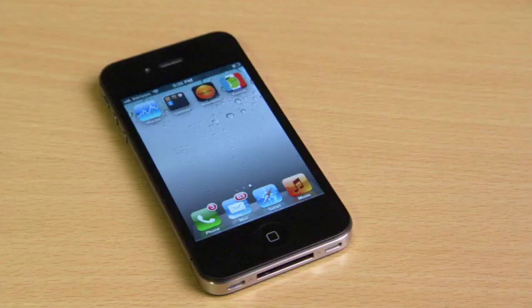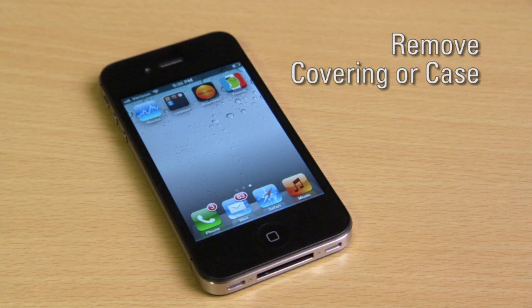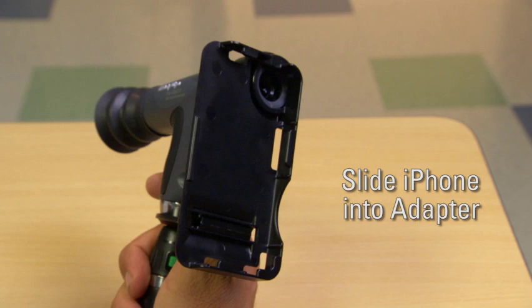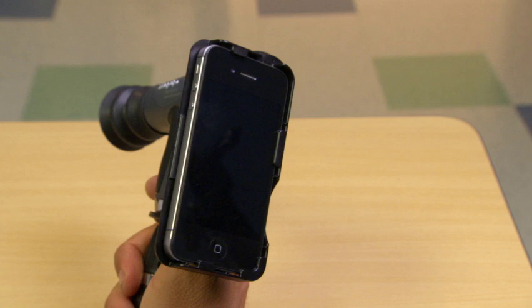To attach the Apple iPhone, first be sure to remove any protective covering or case. Slide the Apple iPhone into the adapter, being sure that it is fully inserted. You'll hear a click. Ensure that the iPhone camera lens lines up with the eyepiece of the ophthalmoscope.